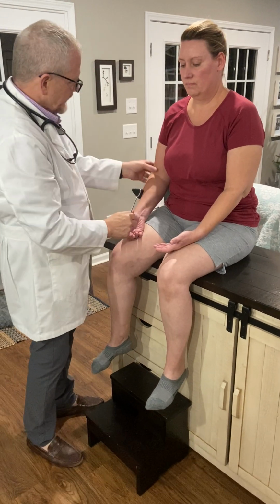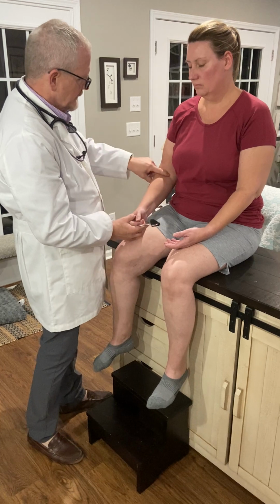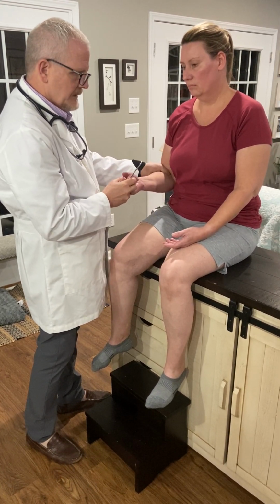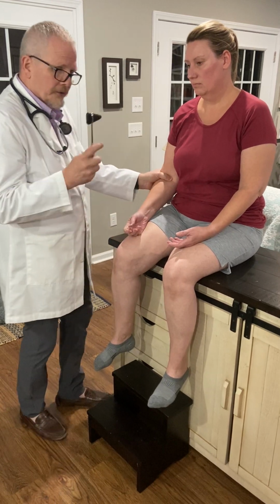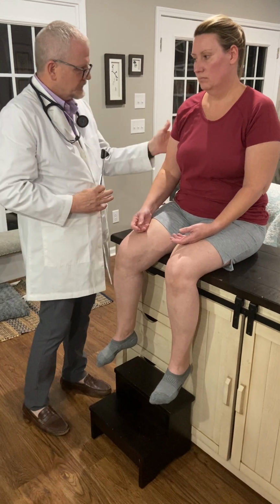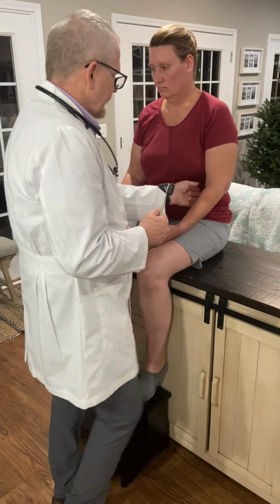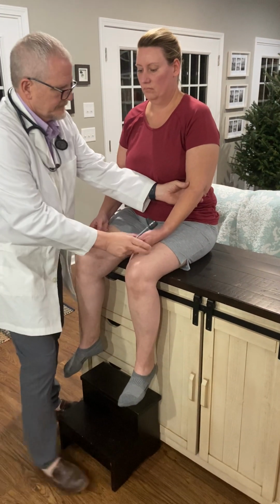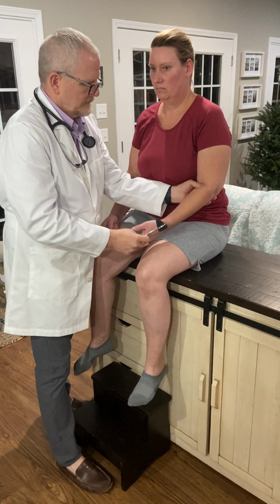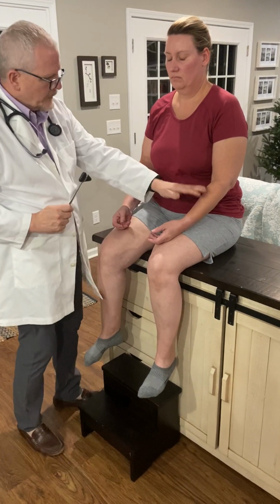And now we're going to do the bicep. Just relax. Let me do it for you. Okay, I'm finding the tendon right there. And we're going to use the pointy part. Okay, and we had contraction of the bicep and we had flexion of the arm. Okay, same way with that arm too.